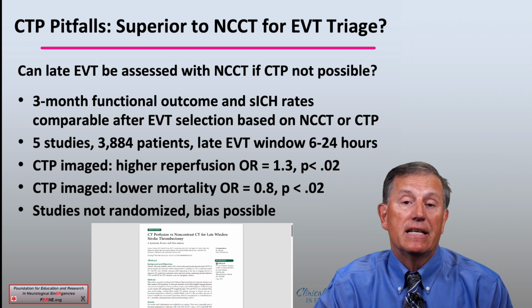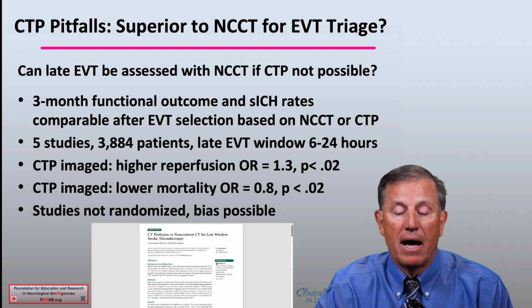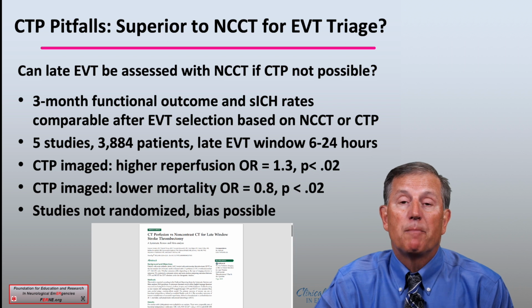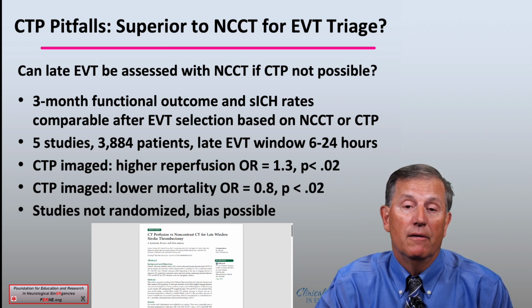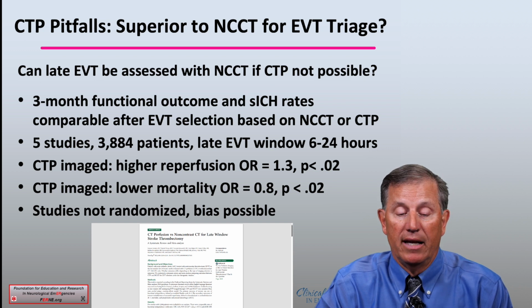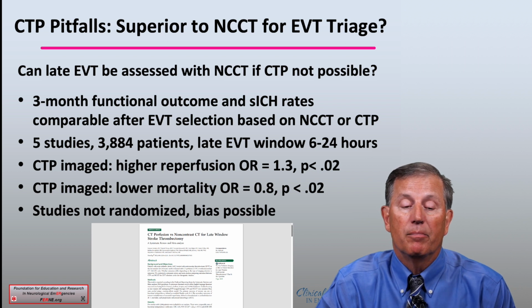However, it is still possible to refer for EVT using a non-contrast CT alone if you do not have CT perfusion available in your center. And remember, from this systematic review, these studies were not randomized, and it is possible that there is some bias. That is, it may be that there's higher rates of reperfusion and lower mortality related to CTP because this test was given to patients who were more likely to optimally benefit or receive EVT therapy.